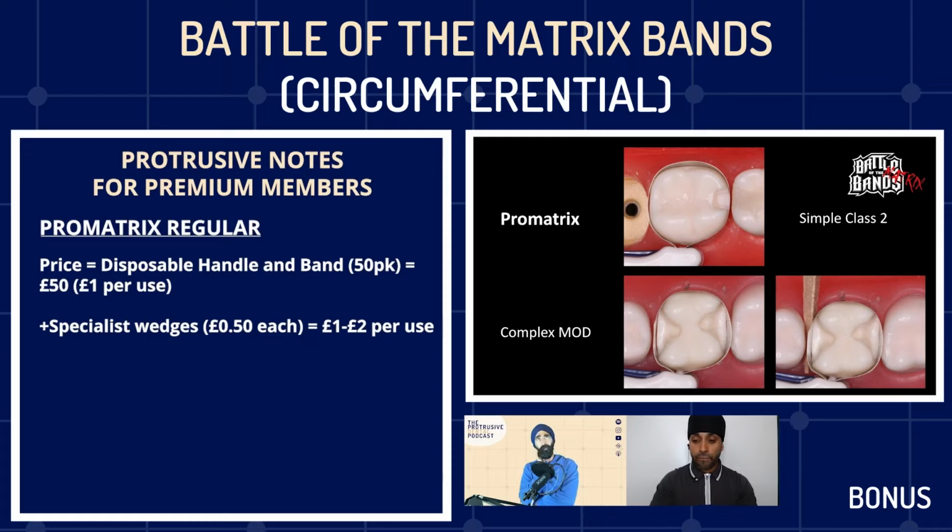But a plastic wedge, I was always taught, is there to maybe create your seal, but it won't give you much separation. The separation comes from the ring, you see? I agree with that as well. So you really need the ring when you do that. Yeah. When we go onto the Palodent 360, where I didn't use a ring, you'll see the actual Palodent wedges did everything with that very thin matrix. But I'm spoiling that one too. That's cool, I'm looking forward to that. So that's a bit later in this episode. Keep watching. Okay, so please tell us the rest.